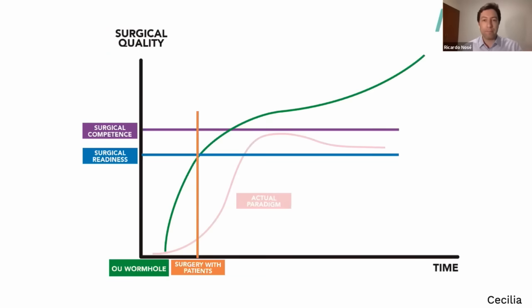We know phaco is a surgery that is step dependent. If you make a mistake in the beginning, it can make your surgery a big nightmare in the middle and to the end. So if you are safe doing all the steps from the back, you'll be a better surgeon for sure.